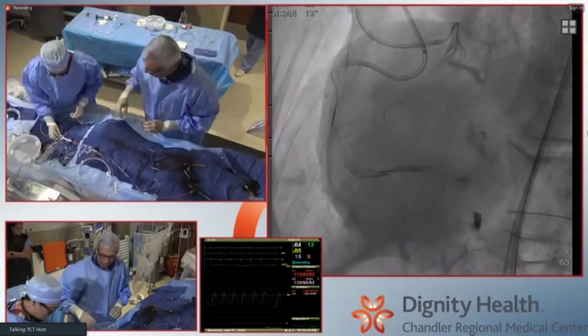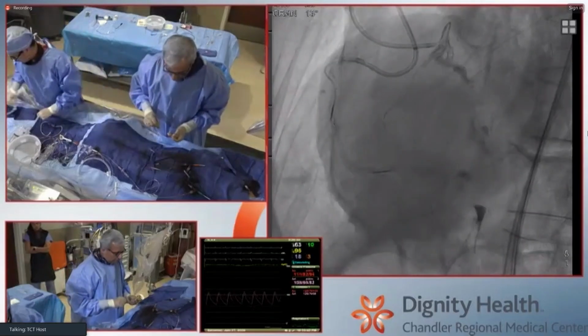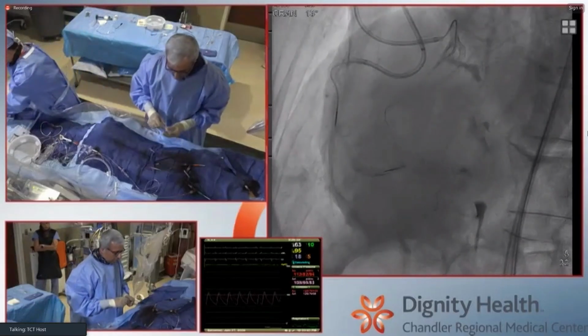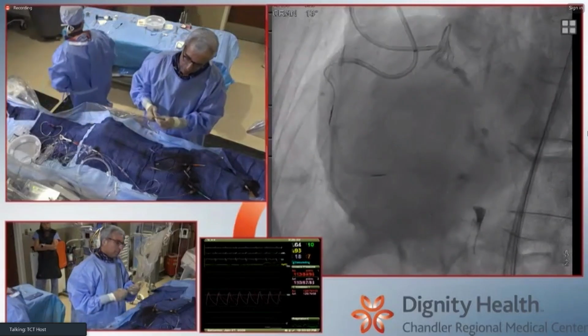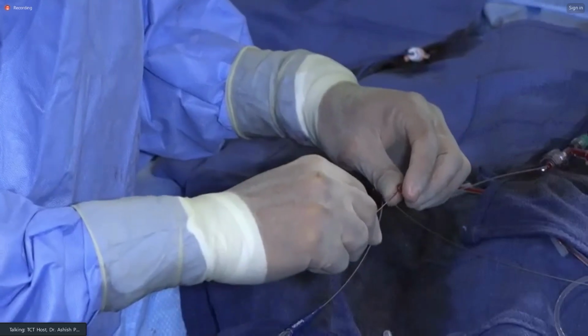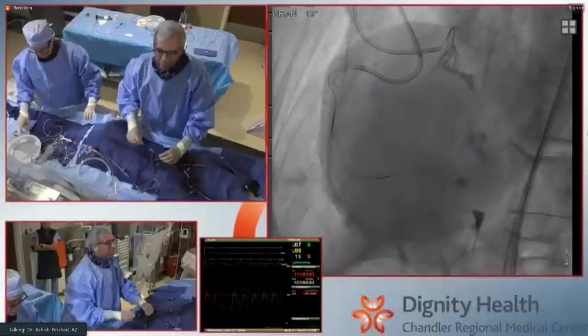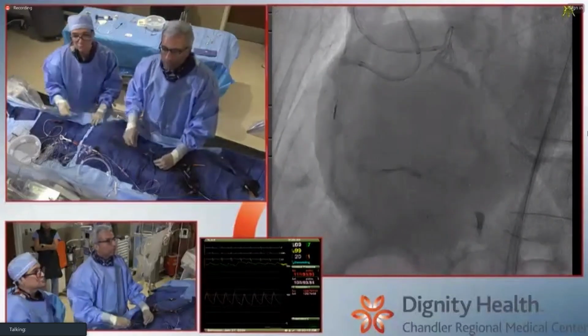I think Pilot 200, Raider, Mongo, even Mongo ES if you have to come retrograde hard, and then do the same thing antegrade and complete your reverse CART. Because I just don't see the Fielder XT working. It's just going to end up getting pushed out over and over. Yeah, exactly. That's what we were saying.